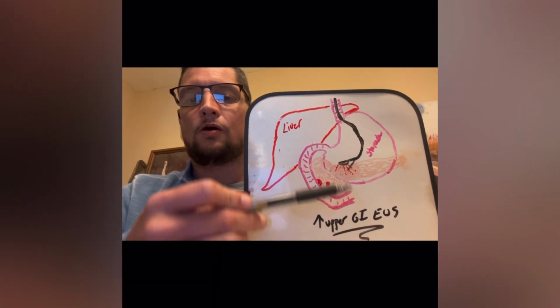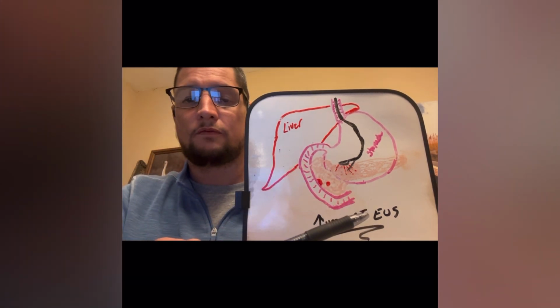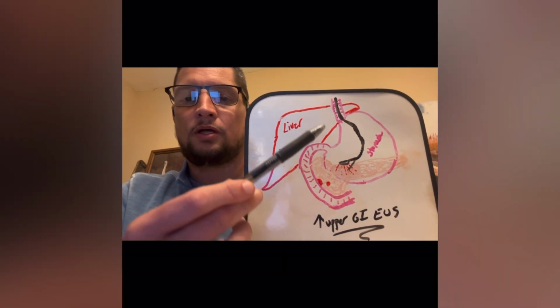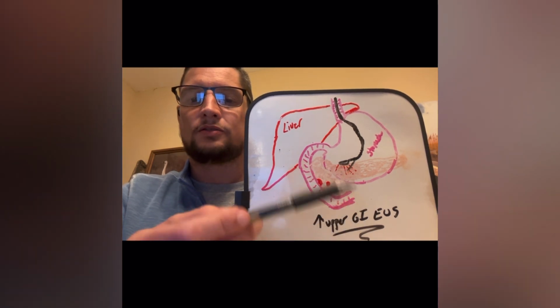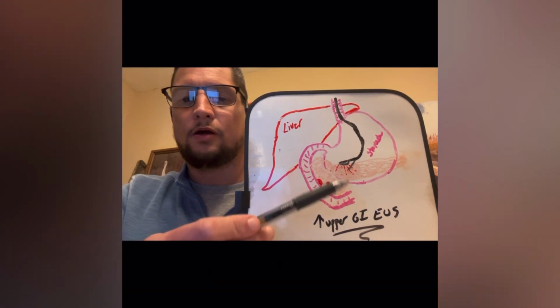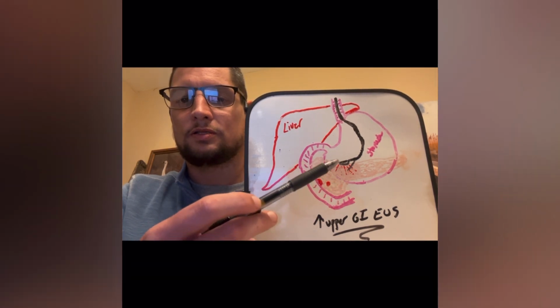Rather than doing the general type of ultrasound where we're staying on the outside of the skin, we look through the fat and things that are built up between there and the pancreas and the stomach. This is a more direct route, and it gives us a better view of what we're looking for. Right here, we're looking for this fluid buildup, which is causing these pseudocysts.